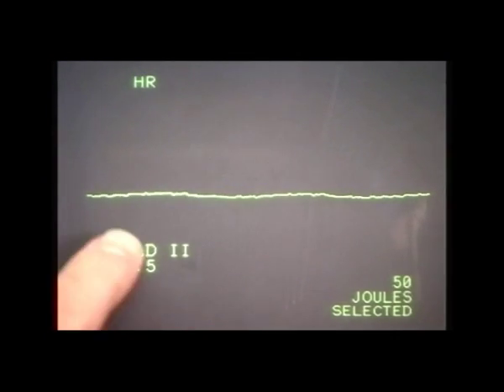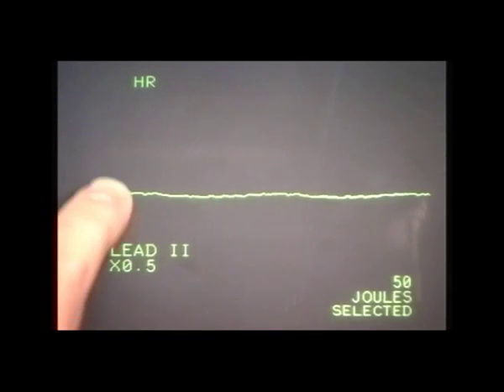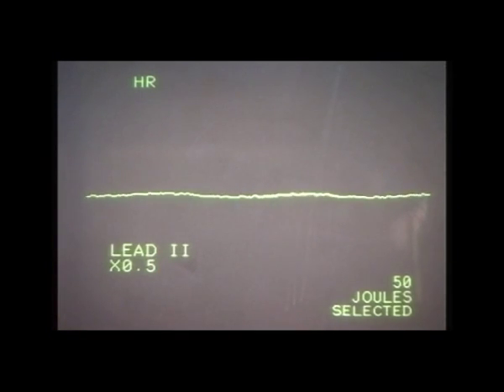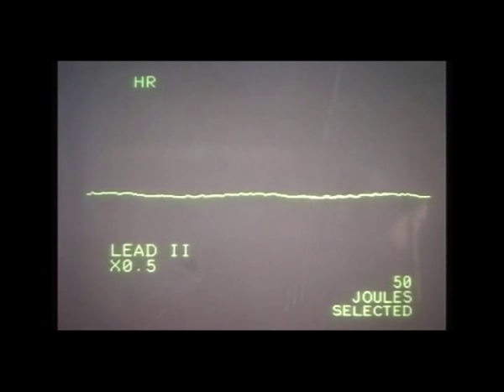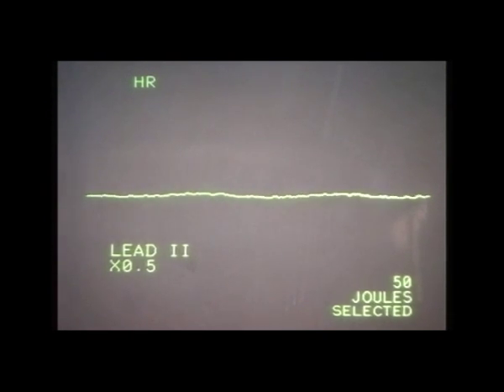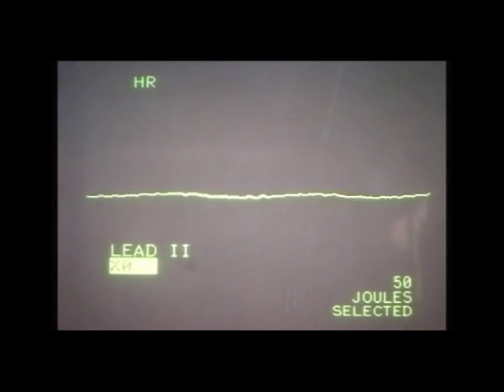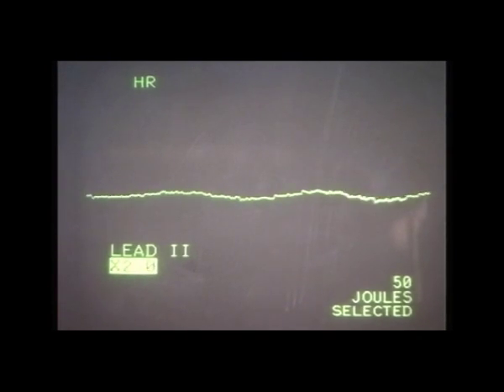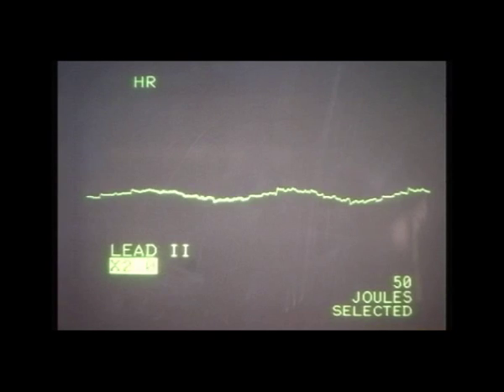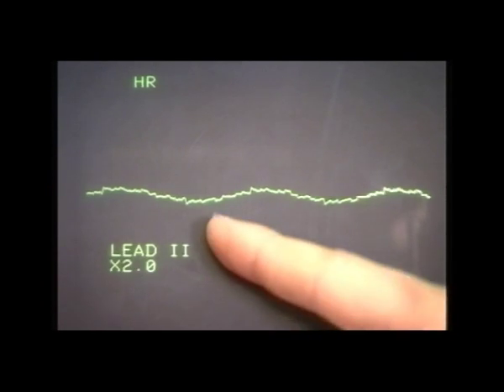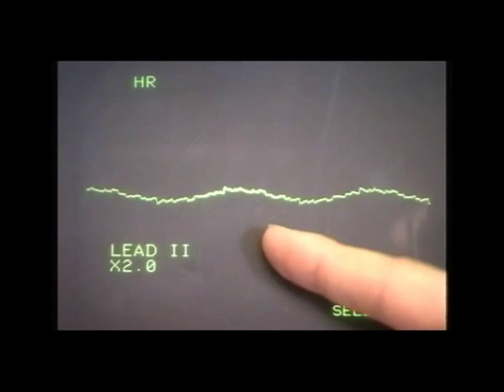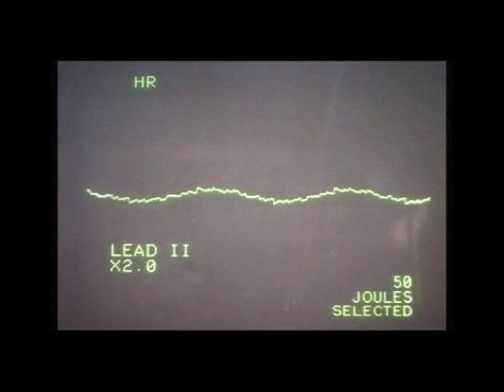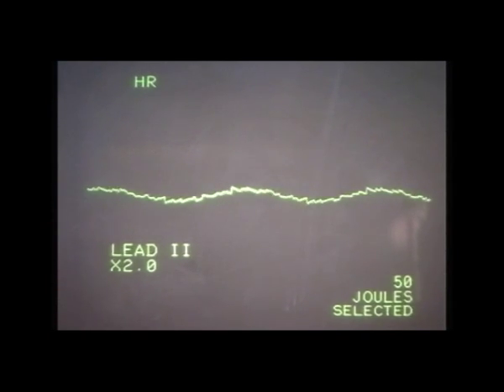Well, here David, I can see in this line that it looks fairly flat, but it's a little bit jaggedy. Are we actually looking at a fine VF here, or is this an asystole? We may well be looking at an asystole, but what we need to do, if we see this on the screen, is increase our amplitude. By increasing our amplitude, we may decide that this is a fine VF and treat it as such. We see some small deflections across the baseline. If we decide it's not a fine VF, then we're going to treat this as an asystole.